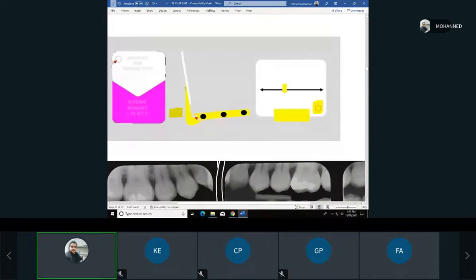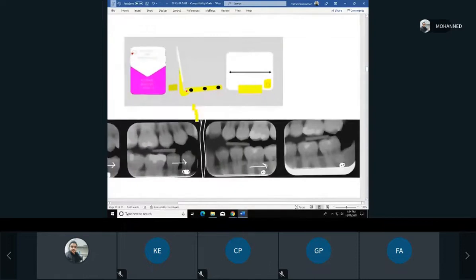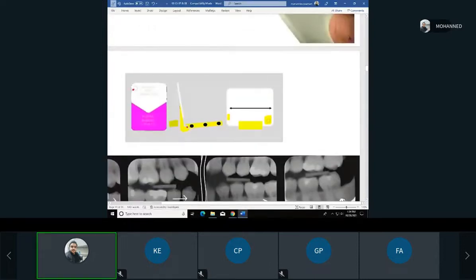White in sight means you will expose the white side of the film, because that's the tube side. And then the dot is in the slot, so you always make sure that your dot is in the same location. Does that make sense? You always put the dot in the slot, so you're not putting it upwards, right?